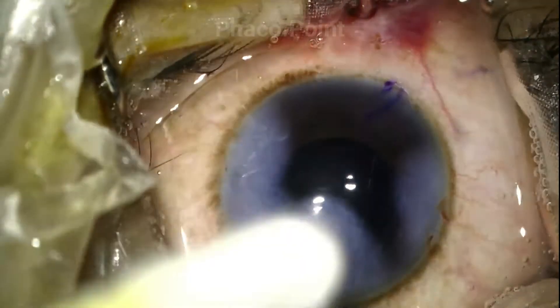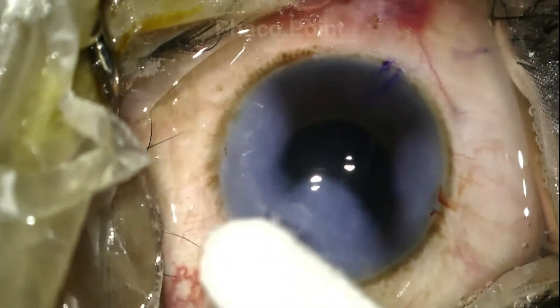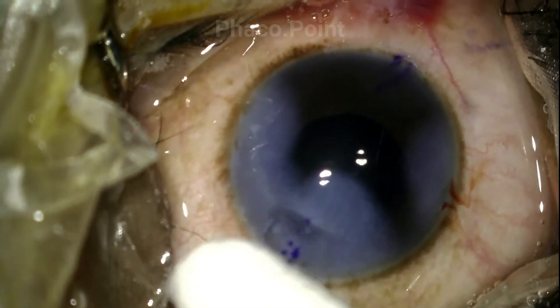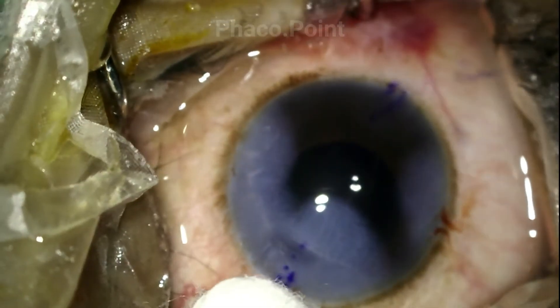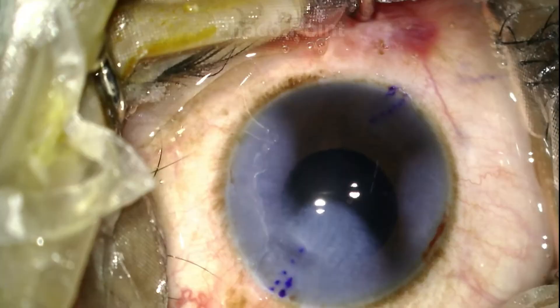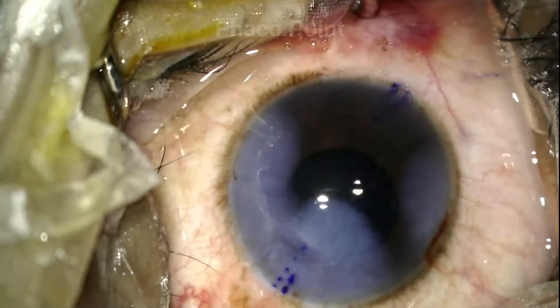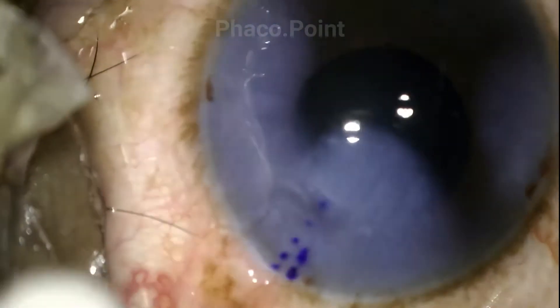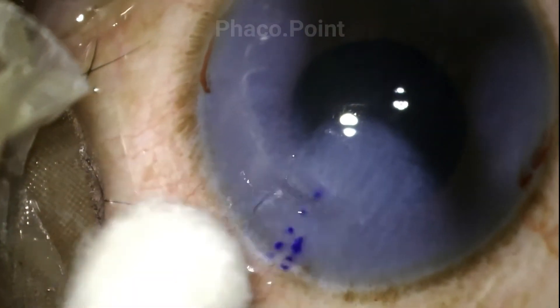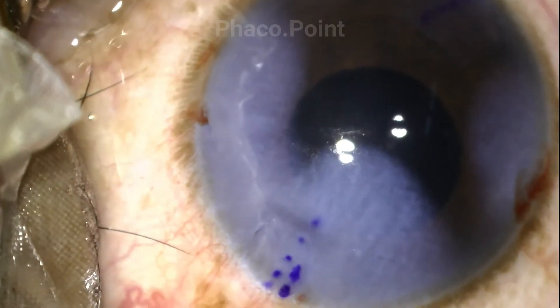Finally, we'll see the end result of this surgery. Despite a significant radial tear in the main incision and despite significant manipulation of that tear with the FACO probe as well as during IOL insertion, we have what appears to be a fairly stable, well-settled wound at the end.